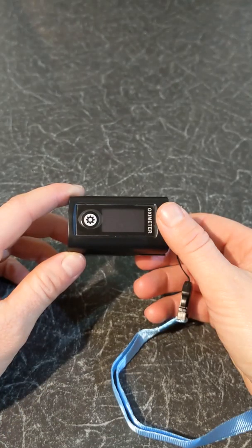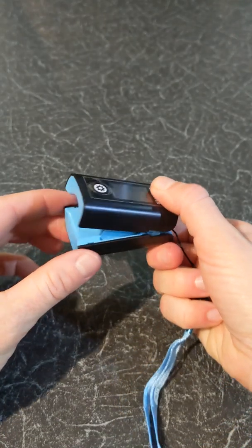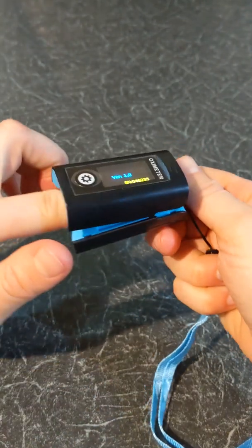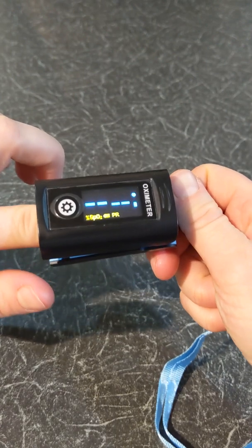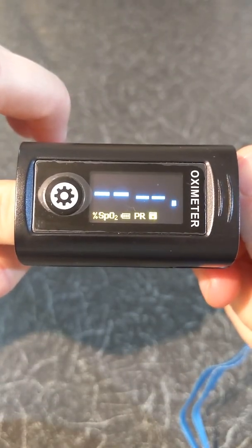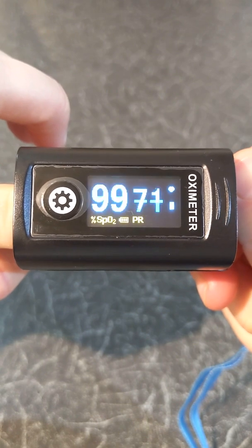To start a reading, open the clip and insert your finger inside the rubber cushion as illustrated. The oximeter will power on automatically and start to measure your pulse rate and your oxygen saturation levels. It can take a few seconds for the oximeter to take a reading.